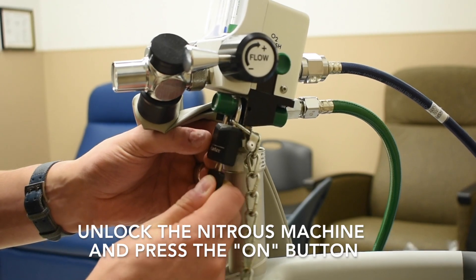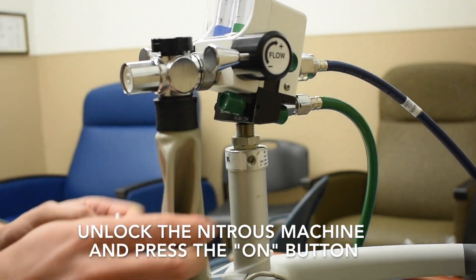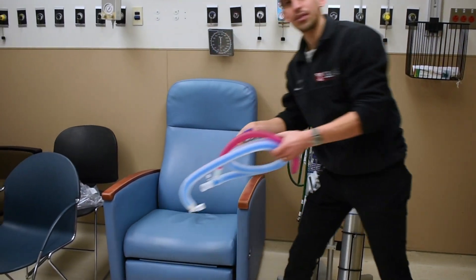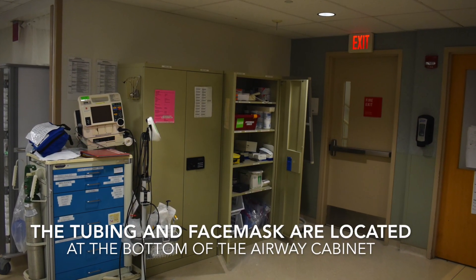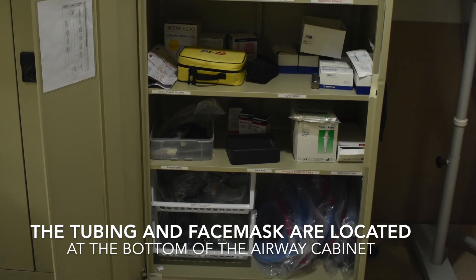First, unlock the machine and turn it on. The on button is the green tab as shown here. You will need the disposable patient tubing and face mask, which can be found in the airway cabinet located near the nurse's lounge in the back of the emergency department.